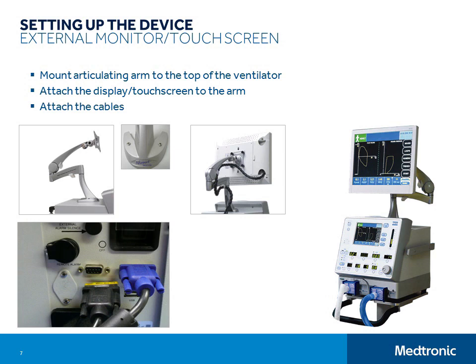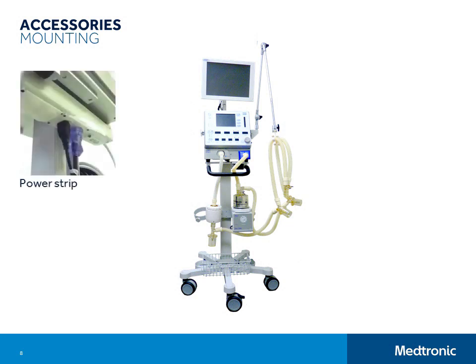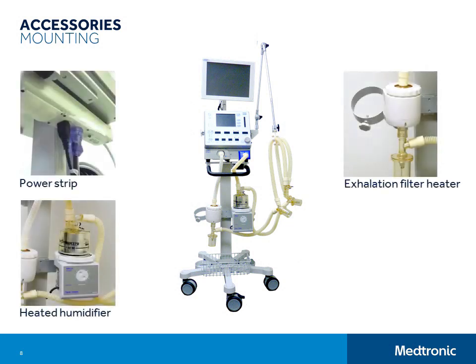Both the flat panel display and the touch screen have cables that connect to the VGA port on the rear panel of E360 using a 15-pin male connector. When connecting the external touch screen to the T model, you will also need to connect the 9-pin female RS232C cable from the external touch screen to the COM1 port on the rear panel of the ventilator. At this time, go ahead and attach any other accessories you plan to use like a power strip, a heated humidifier, an exhalation filter heater, or E-cylinder holder.